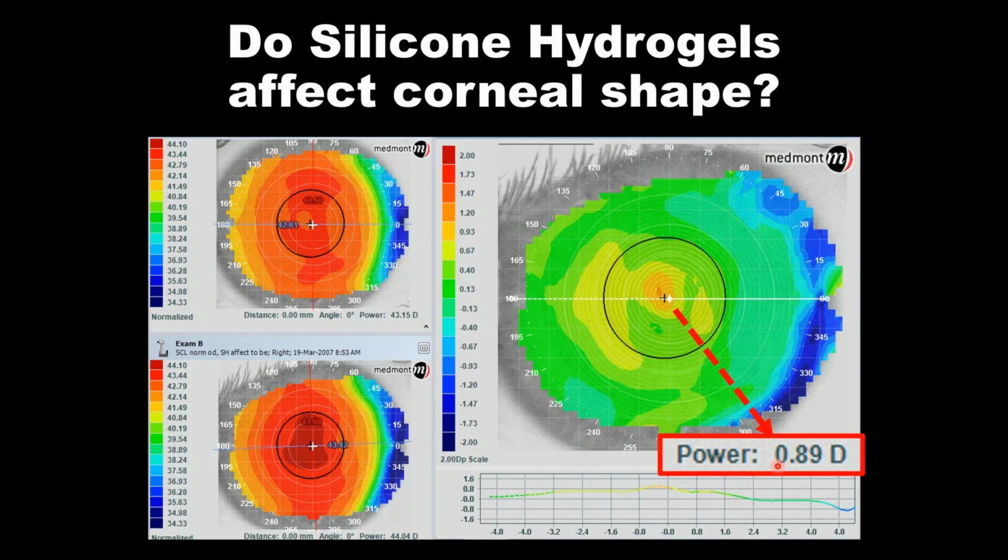And we know that from various studies. The silicone hydrogels have a high modulus. In other words, they're very rigid. They're far more likely to mold the eye than HEMA soft lenses. So this is a way that we can understand, are the soft lenses that we fit, or even, of course, the rigid, are they altering eye shape over time?